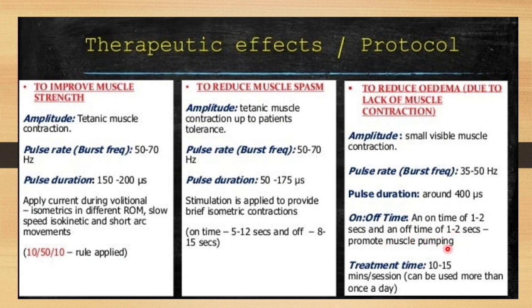So in order to promote the muscle pumping effect, the treatment time will be 10 to 15 minutes per session, and it can be used more than one session per day. So 1 to 2 times per day can be used. So these are the therapeutic effects and their protocols which should be followed.